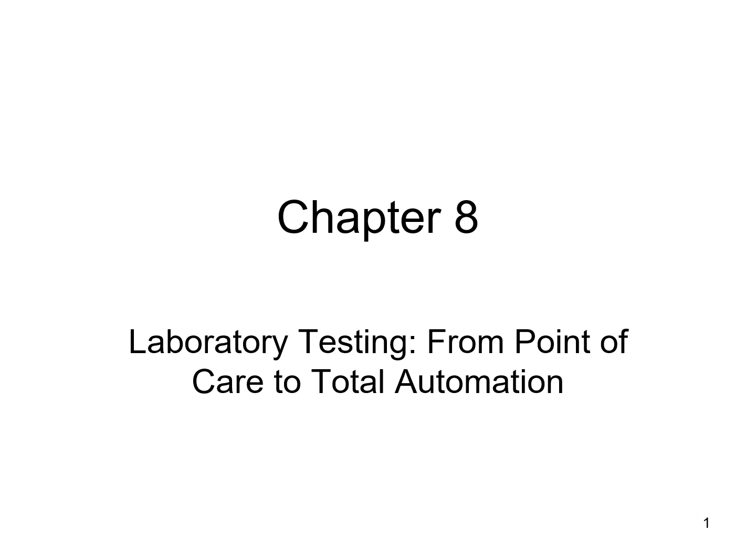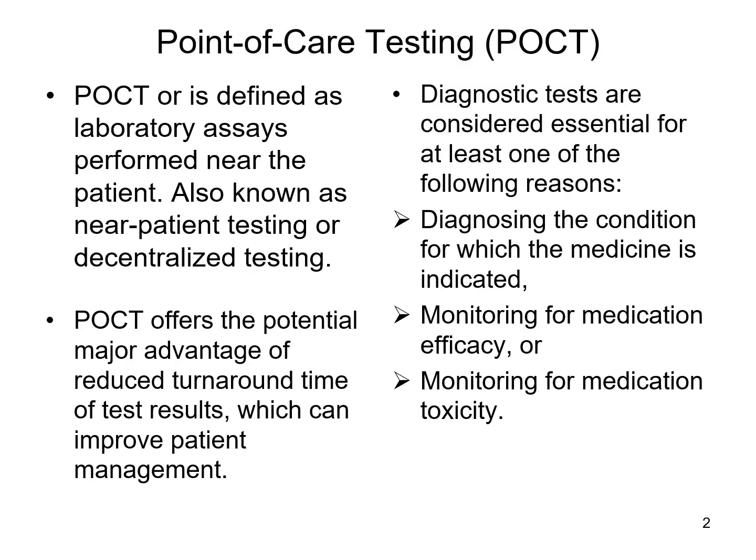This lecture will cover Chapter 8, Laboratory Testing from Point of Care to Total Automation. Point of care testing is any sort of laboratory test or assay that's performed near the patient. And so this is often considered bedside testing, near patient testing, decentralized testing. In other words, it's away from the actual laboratory and closer to the patient. So the test is brought to the patient rather than the patient sample being brought to the test analyzer.